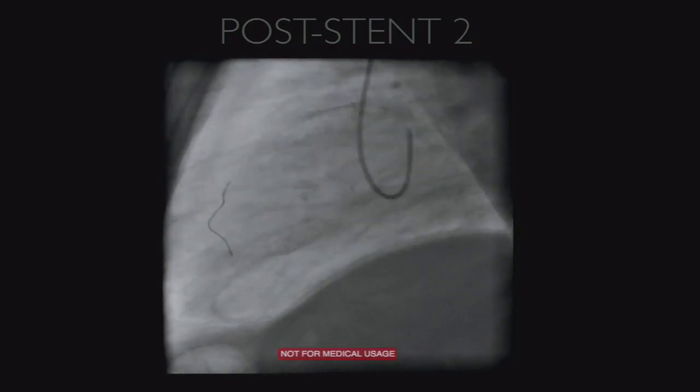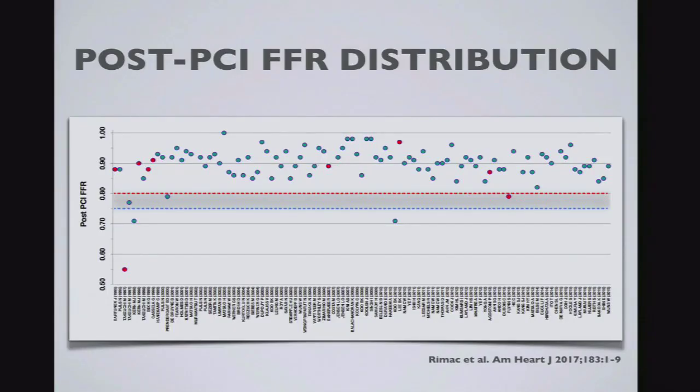And then at the time, we were interested to look at the literature, and this is a paper done with one of my PhD students. Basically we reviewed everything prior to the emergence of the new fiber optic pressure wires, and this covers something like 20 years of FFR measurements after PCI, including the red dots after PTCA. And you see there is some variation over the years. As you see also, there is no recent improvement or increase in the post-PCI FFR values. So that's observation number one.